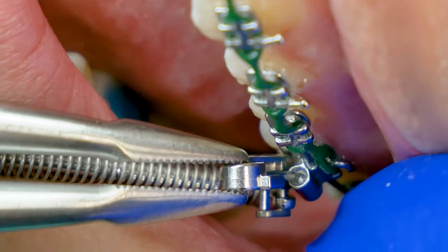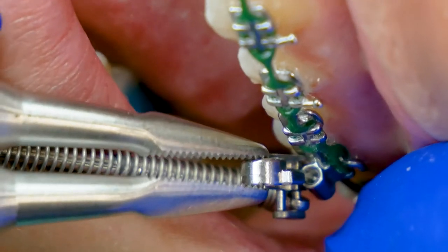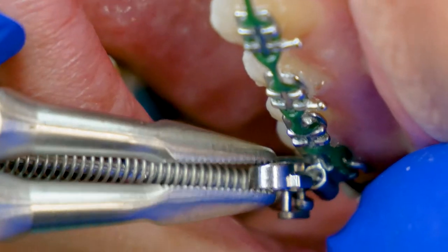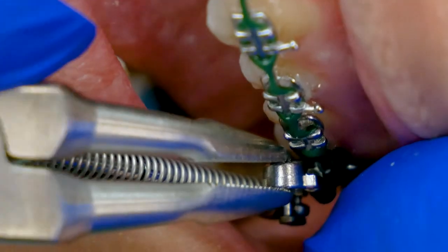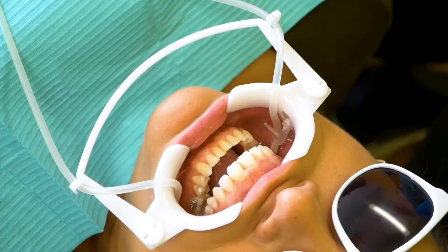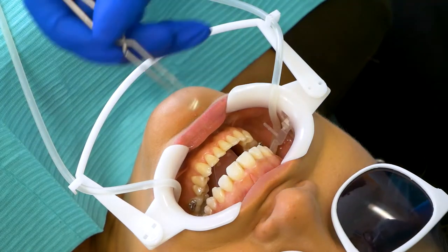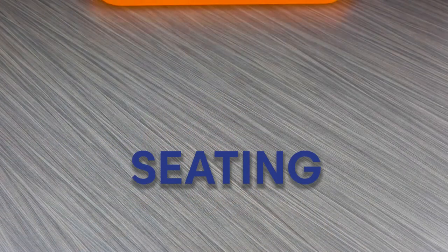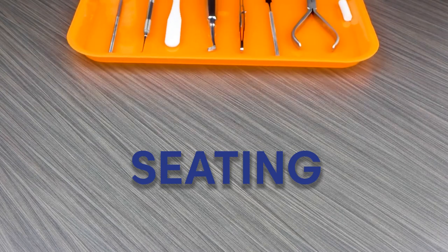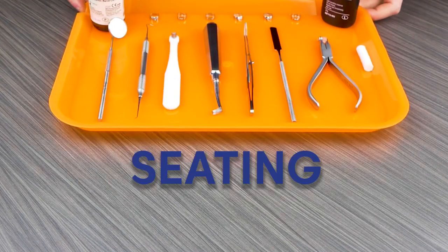The reason your doctor may use bands is if more force needs to be applied to the bracket, meaning that the force is too strong to be attached to glued-on brackets. The process of placing these bands is called seating.